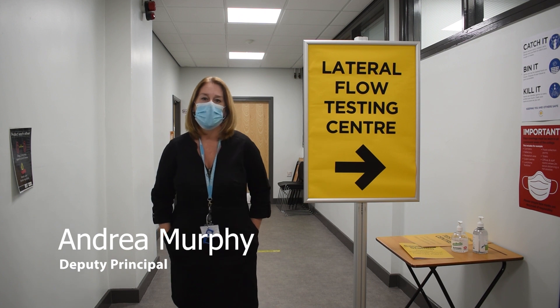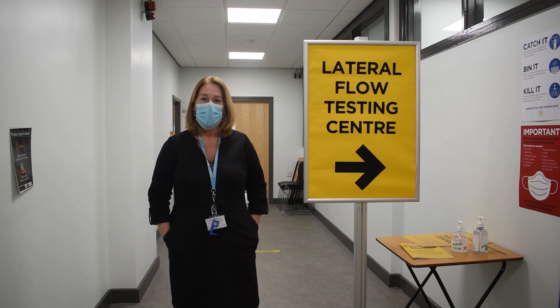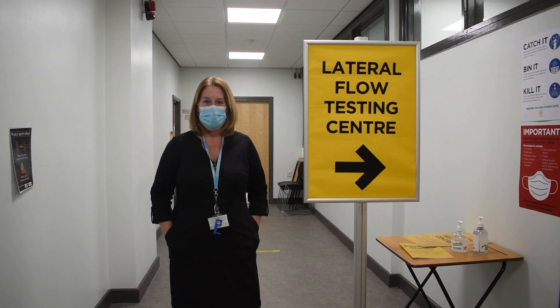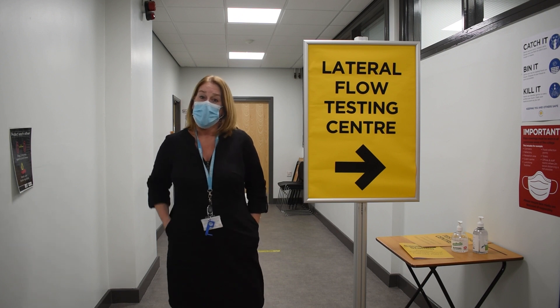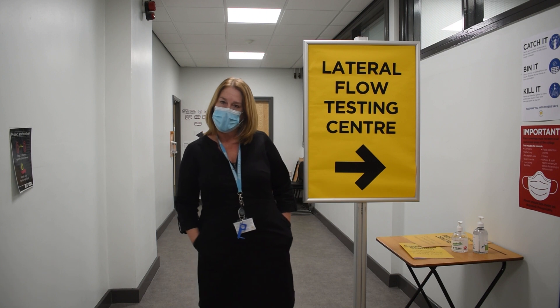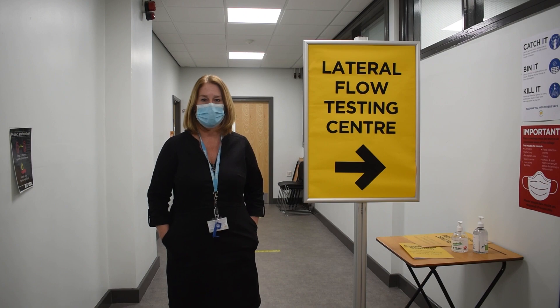Hi, my name is Andrea Murphy and I'm the Deputy Principal here at Hotwood Hall College. I know that lots of you will be really eager to get back to college and we can't wait to see you, but I know that some people will be quite nervous about getting their lateral flow test. So I'm going for my test now and I just invite you to come along with me and hopefully feel reassured by how easy, quick and safe it is.